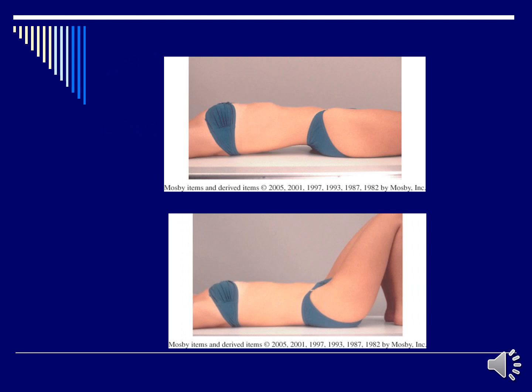Now, when you're looking at the female, you see how the curvature of a female is a little bit more lordotic than most males are. So you want to ensure that you are flexing those legs and putting a sponge up underneath your patient, whether they are male or female, to ensure that the spine stays parallel to the image receptor, which is going to allow the intervertebral disc space to remain open. So it's still going to be the same concept. 40-inch SID, perpendicular beam, iliac crest and mid-sagittal plane, flex up the legs, and this time we will protect the patient's mammary glands instead of the gonadal region.